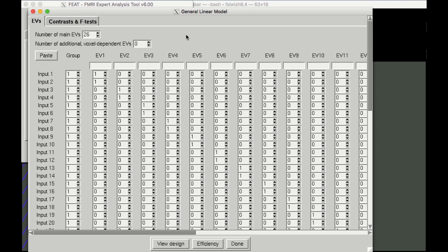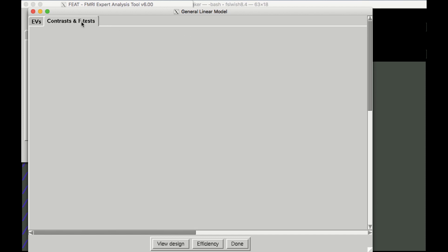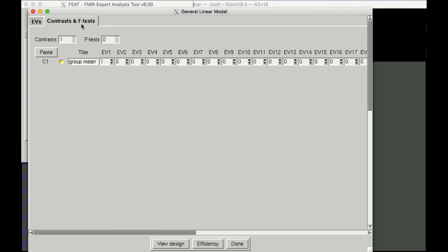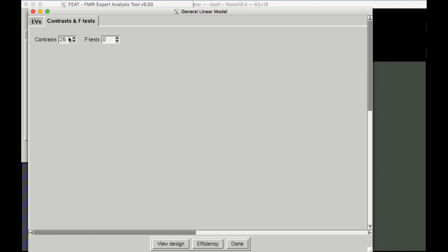When you've finished, click on the Contrast and F-Test tab, and change the number of contrasts to 26, and press Enter.